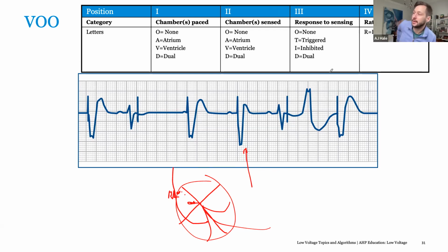Yeah, absolutely. So for those of us like Elvis who are taking the IBHRE, which is a very fun test, this will be something that will come up. Basically you'll see this manifest itself in a pseudo-fusion where we'll have a pacing spike occur directly before a QRS, but the morphology of the QRS looks exactly like the intrinsic morphology.